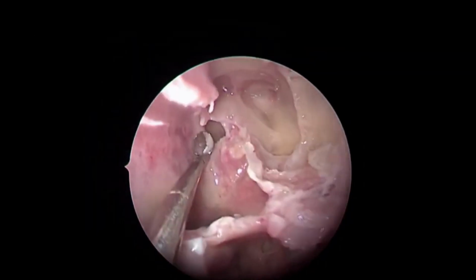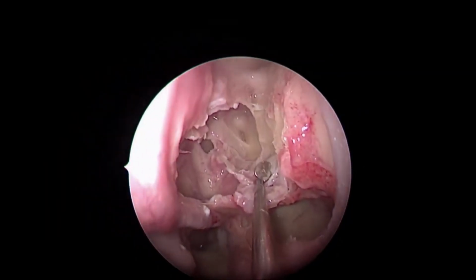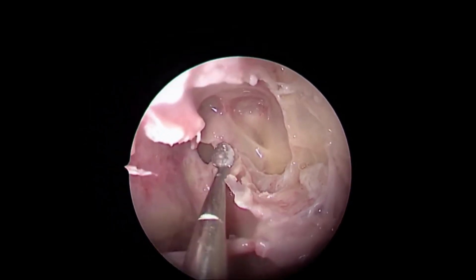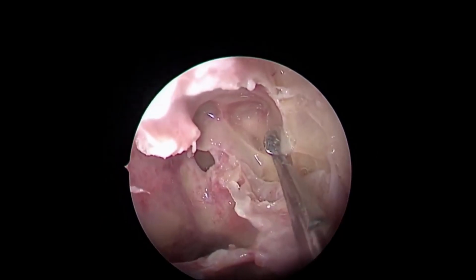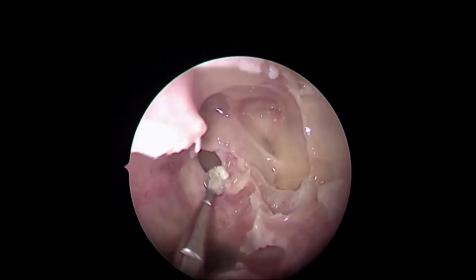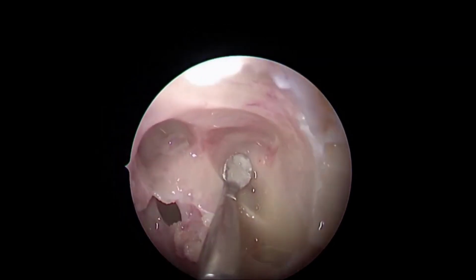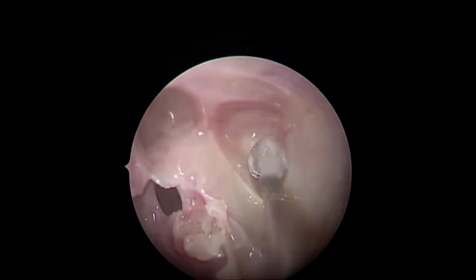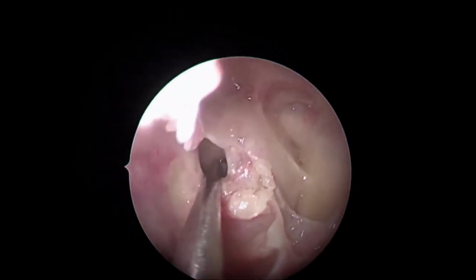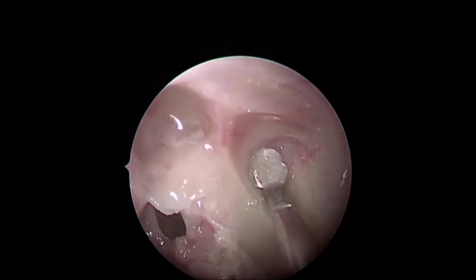But see, what can simply prevent this is, before doing a post-ethmoidectomy, go medially and find this sphenoid sinus ostium. Taking it as a posterior limit, now you carry out your post-ethmoidal work, not going behind this. And you can simply prevent this Onodi situation. Here, this is Onodi. The optic nerve is not running through the sphenoid sinus. See this? The optic nerve is running through this post-ethmoidal cell known as the Onodi cell.